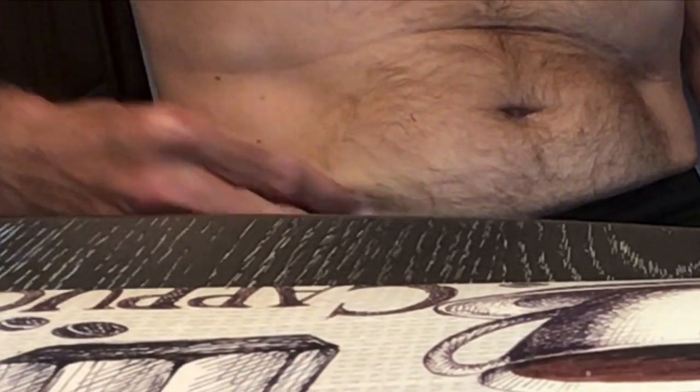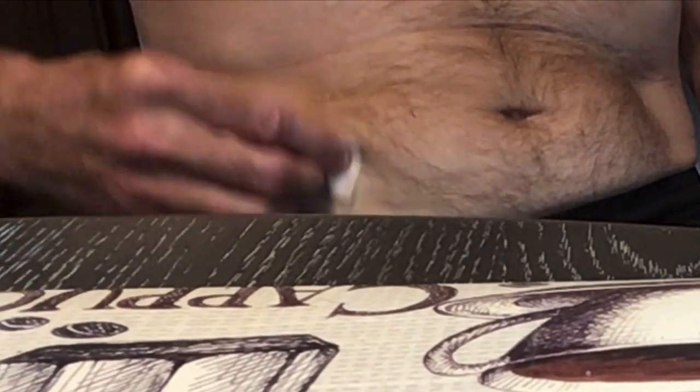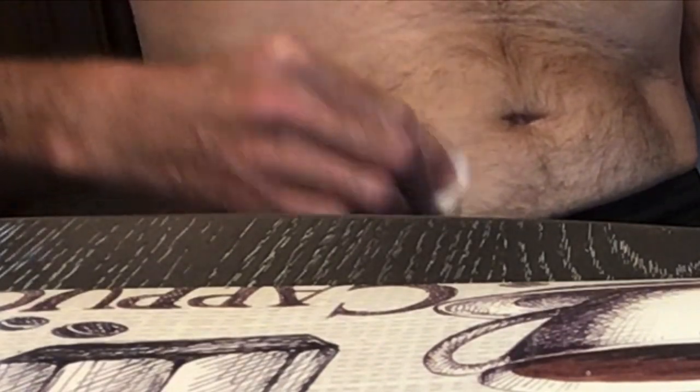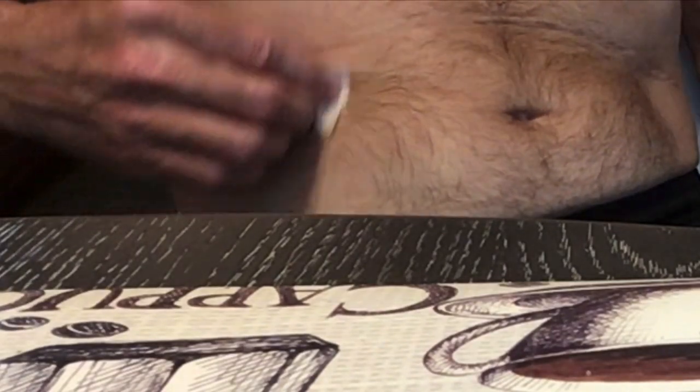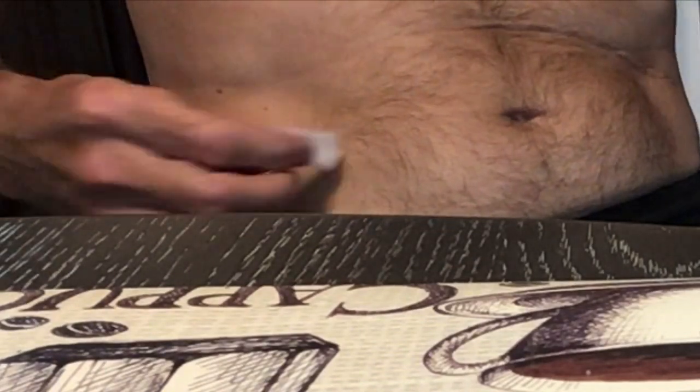I don't know if you're not supposed to pinch the area or not, but I haven't really found a definitive answer on that. That's what I did last time and it worked, so I'm gonna stick with that.